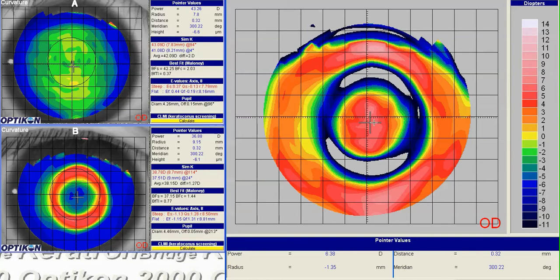That said, I think depending on how long the patient has been wearing lenses so far, just giving the patient a little bit more time may get a little bit more homogeneity in the treatment zone and take care of some of that residual myopia. So I would say if this patient has worn the lenses for 2 weeks already, let's go ahead and make a change to the topo demand. If it hasn't been 2 weeks, I'd give the patient a little bit more time to see if the correction does kind of solve itself.